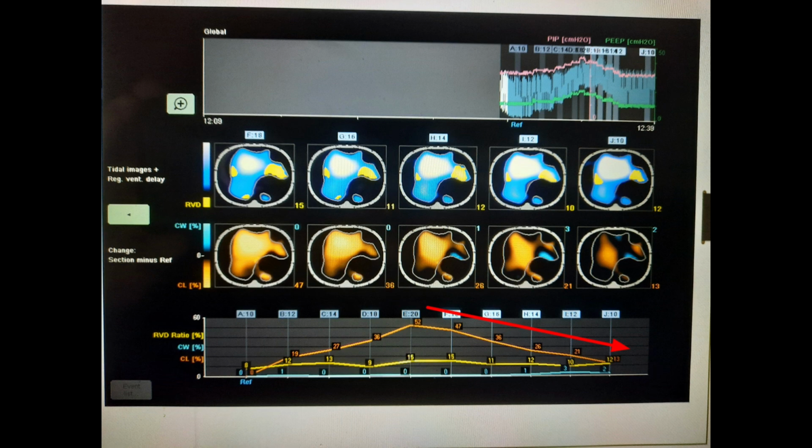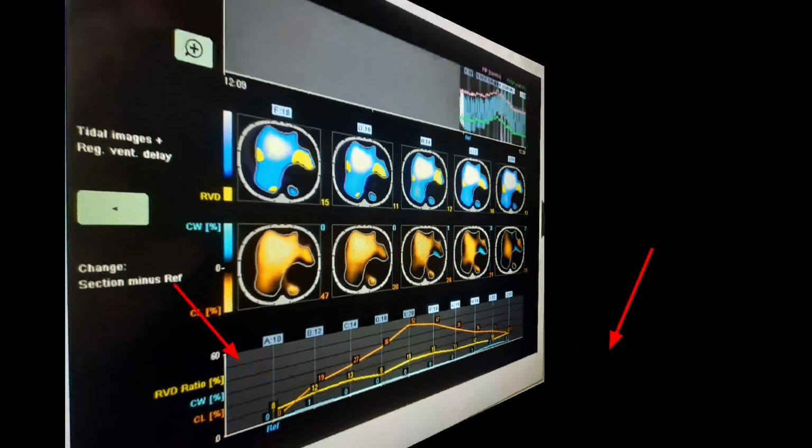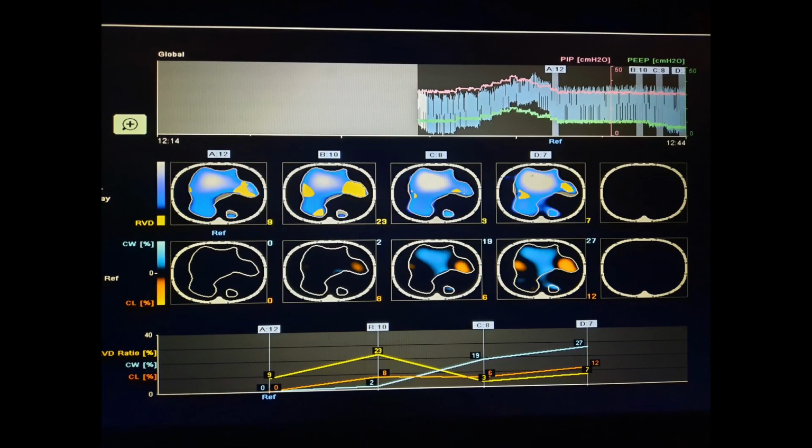So at this point, the least loss of compliance, or the best compliance, would be somewhere in the region of 10, and we didn't even test 6 or 8, which could maybe potentially be even better than 10. Knowing that the optimal PEEP, at least when comparing 20 to 10 and 10 to 20, the incremental and decremental PEEPs, we saw that 10 was optimal. So we went lower to 8 and 7 quickly just to test out the optimal PEEP.